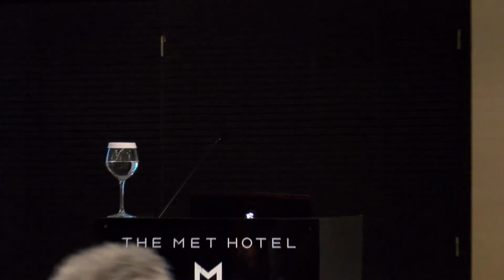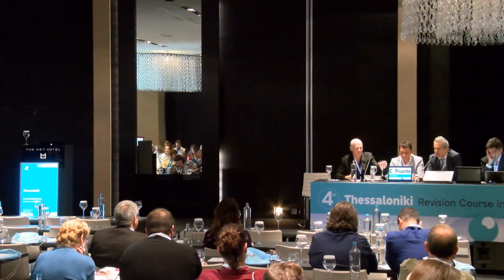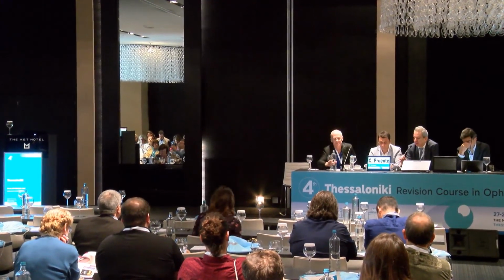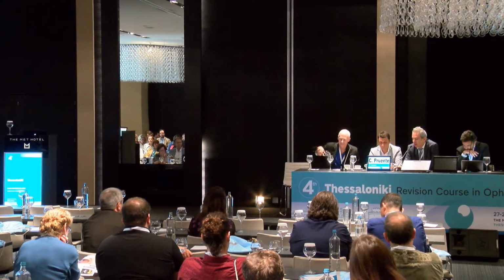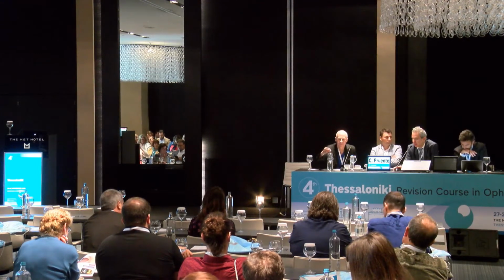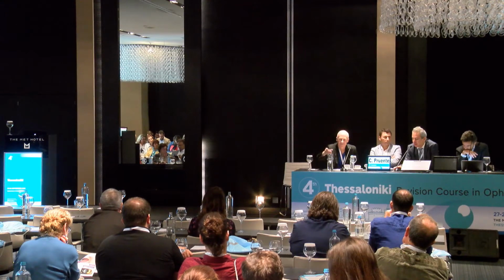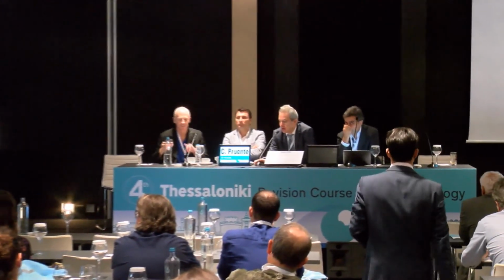So, treating irregular astigmatism in an ectatic cornea is, in my opinion, and I think we all agree on that, a completely different story compared to treating irregular astigmatism in a non-ectatic cornea. So, there is a certain hype about combined procedures. However, we don't have much evidence in terms of stability, long-term stability, safety, and reproducibility of the results. The only group that published 10-year results was the Athens Protocol group, showing, as always, excellent results. But all other modified protocols are lacking stability results, long-term results, and safety results.